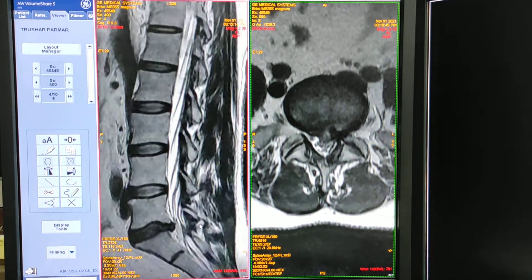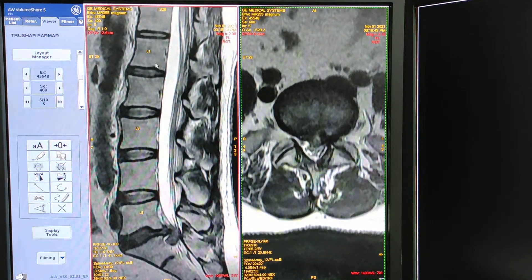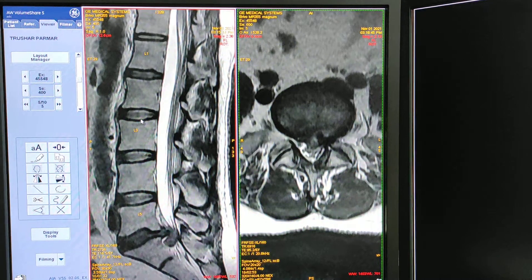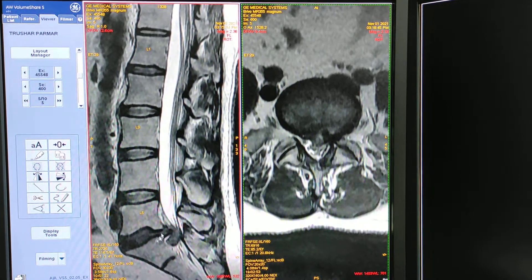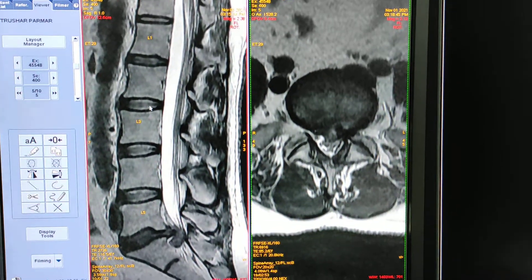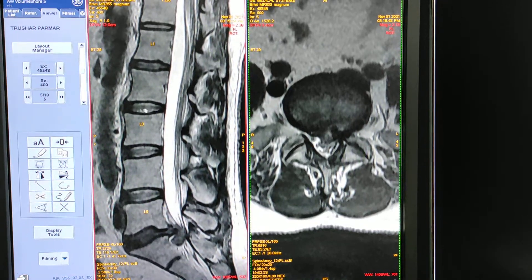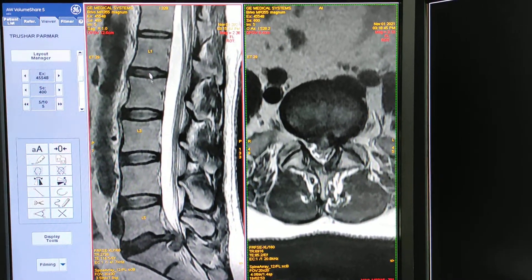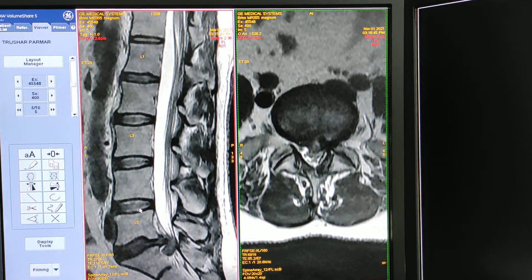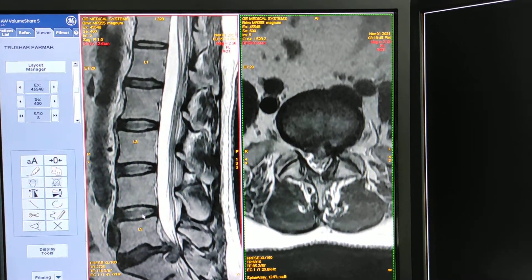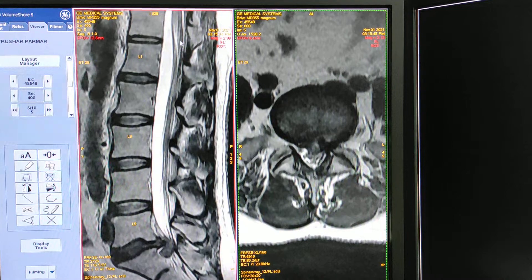First of all we will see a normal view of the disc. This is L1-L2, L2-L3, L3-L4, and this is L4-L5, and this is L5-S1. Here you can see this disc has a normal water content, that's why this is a normal one. All the discs — L1-L2, L2-L3, L3-L4, L4-L5 — you can see they are all containing this white area. This is the normal jelly, the normal water contained in a disc.